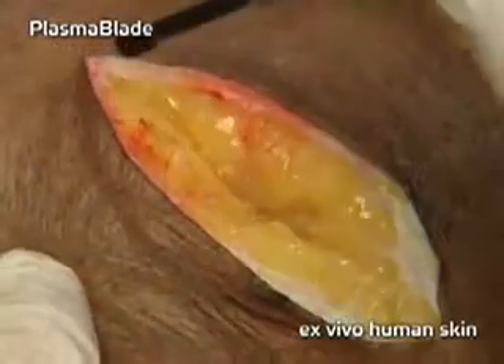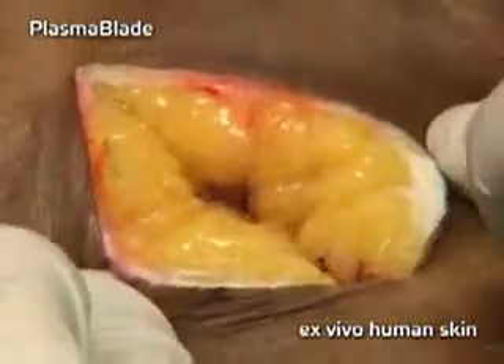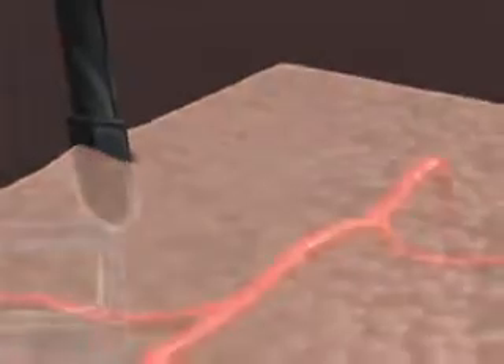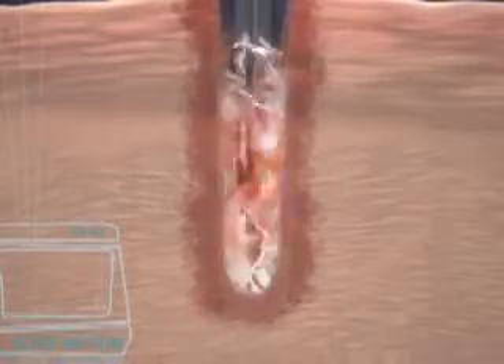The Plasma Blade is a revolutionary surgical device that bridges the critical performance gap between the scalpel and the bovie. Based on proprietary pulsed plasma technology, the Peak Plasma Blade cuts quickly and easily through all types of soft tissue, including skin, fat, and muscle, and works in both a wet or dry surgical field while minimizing thermal injury to surrounding tissue.